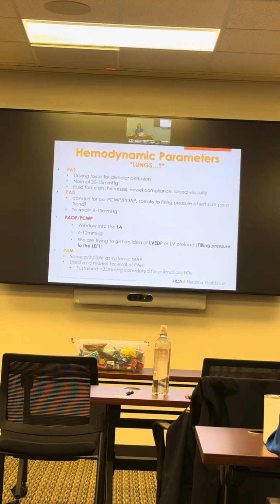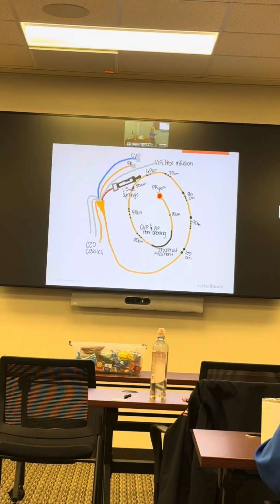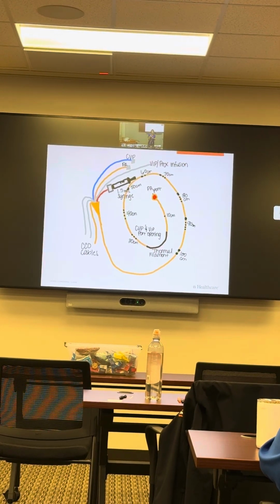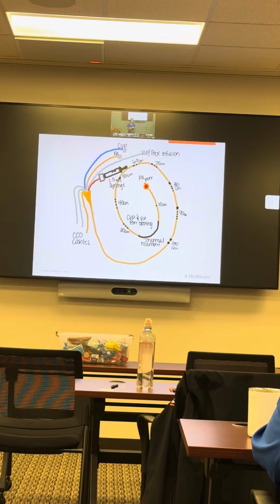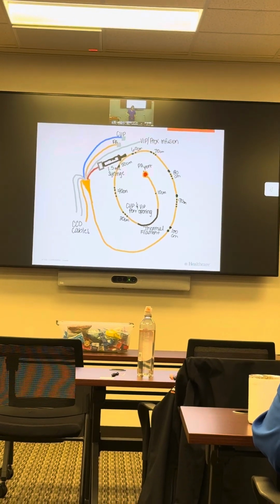So, I do think that it is important before we cover waveforms that we do cover the anatomy of this. So my off-site educators, this is the time to get out your Swan and just kind of follow along with me. I'll try to be very, very clear about what it is that I'm pointing to and looking at, and then my guys in the room, I'll pass it around so you can touch it, okay?